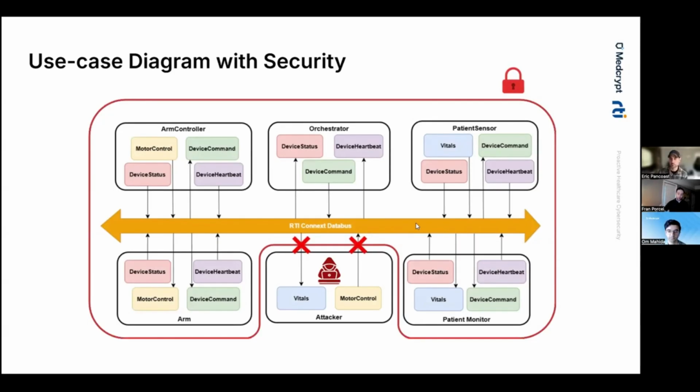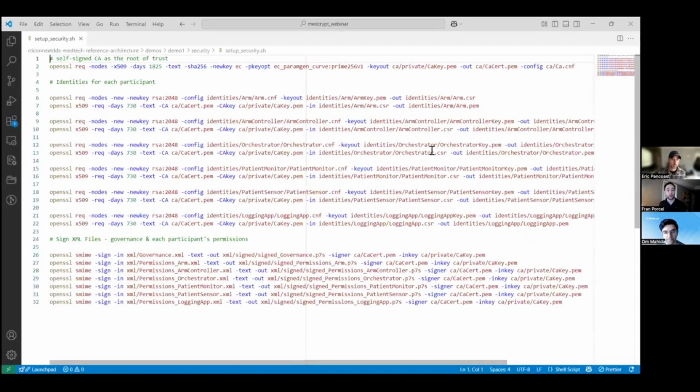Now, before we do that, before I launch the applications that are going to be used in the Connect security plugins and/or security extensions, and also MedCrypt's Guardian, let me show you what, if you were developing this system on your own, you could be doing: self-signing with OpenSSL. And Eric, would you like to make any comments on this?